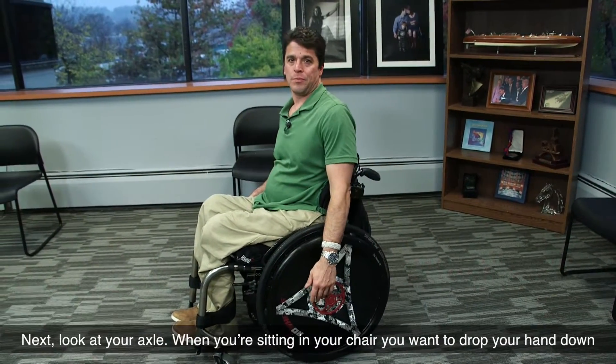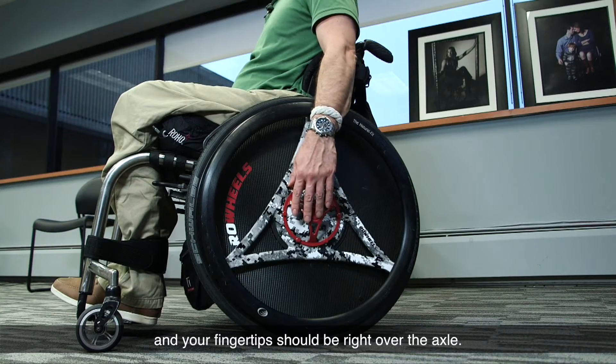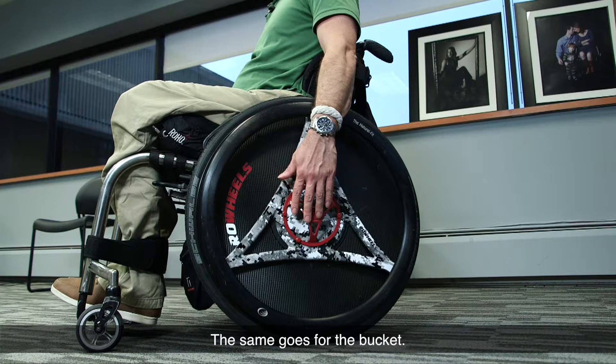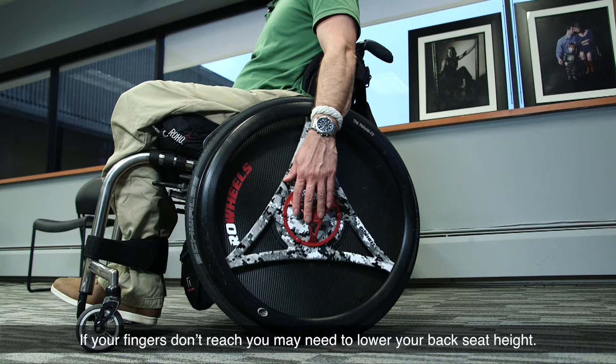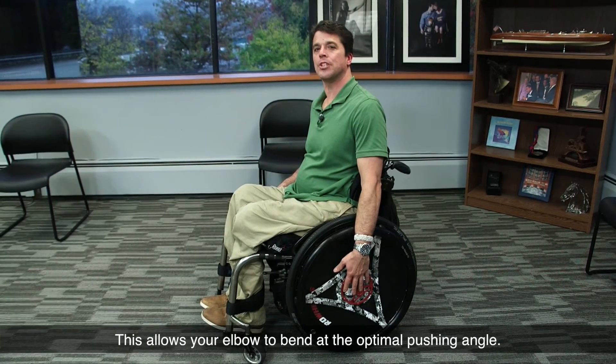Next, look at your axle. When you're sitting in your chair, you want to drop your hand down, and your fingertips should be right over the axle. The same goes for the bucket. If your fingers don't reach, you may need to lower your back seat height. This allows your elbow to bend at the optimal pushing angle.